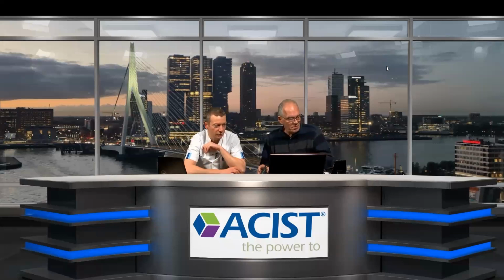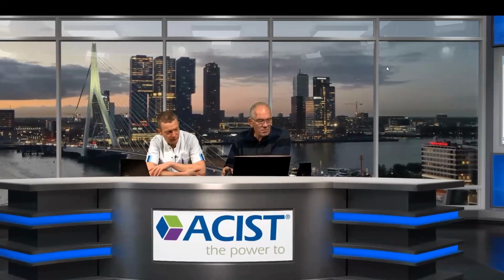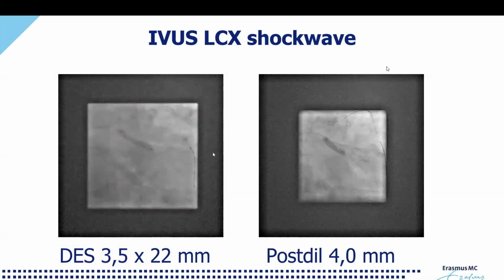And here we proceeded also with a stent, a 3.5 by 22, and then post-dilated with a 4 millimeter balloon.